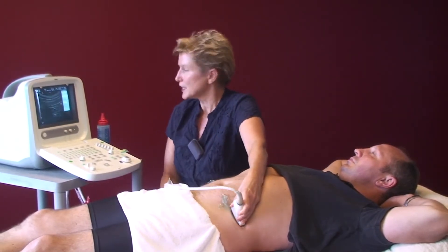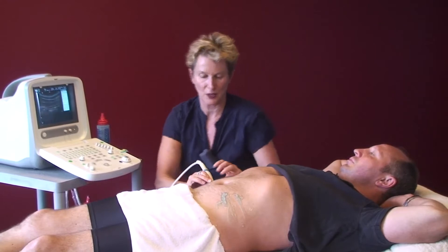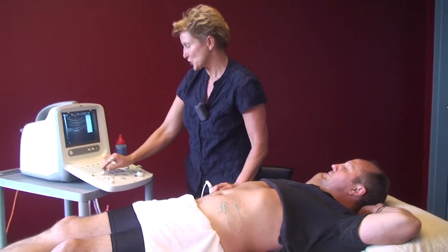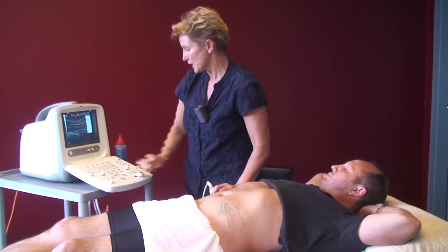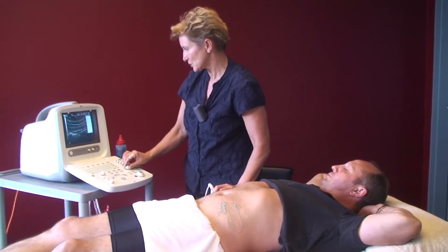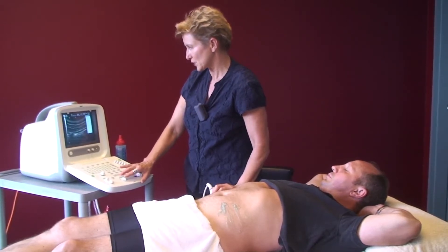Next thing is adjusting our machine. I might switch to this side because I don't want to be standing too far over Alex. Coming to the machine, let's see what image we've got. Adjusting our depth, adjusting our focus position. We want our focus position at the bottom of the image.